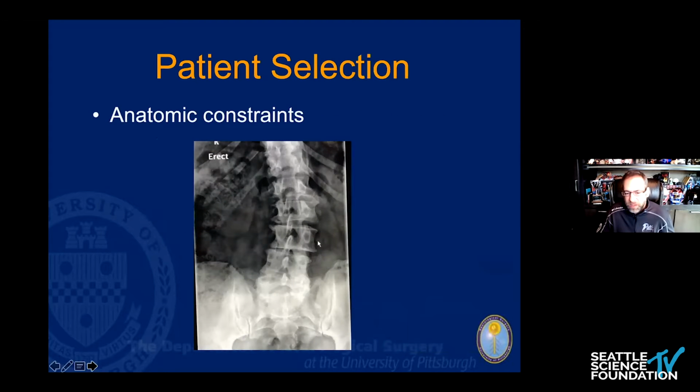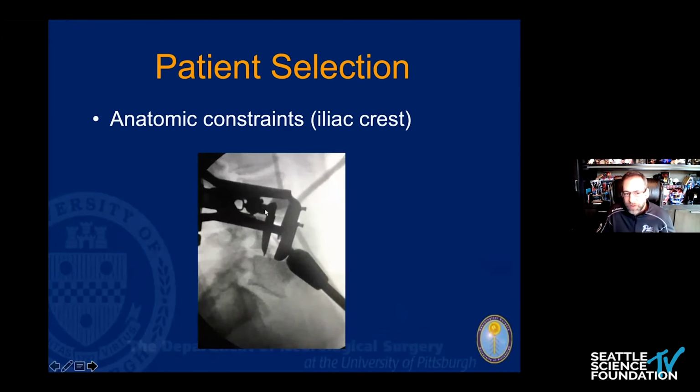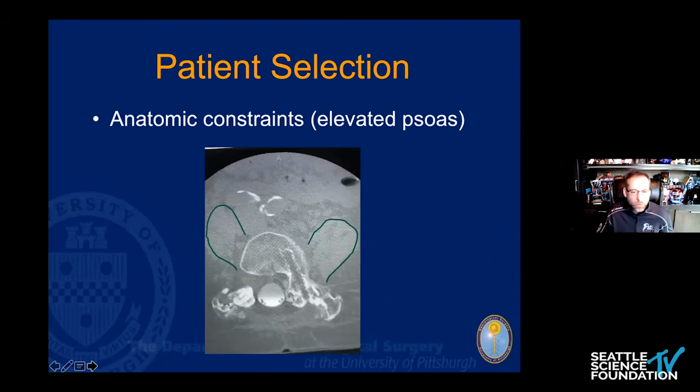understanding when we look at this picture here, we're looking at 4-5. Can you get to 4-5? Certainly not from the left based on that coronal angulation. However, what about from the right side? Well, as Neil showed, we do have multiple options. You can get there. We do have tools. We do have angled instruments, and we have the ability now to be able to get there. And oftentimes, sometimes manipulation of the anatomy itself, pulling the iliac crest back a little bit and taking more of an anterior approach, yet still traversing through the psoas muscle or going pre-psoas.